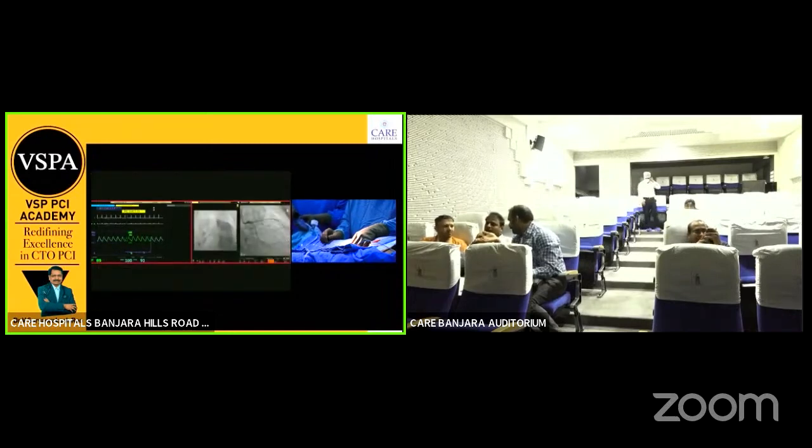Done. 6, 8, 10, 11 nominal, sir. Cranial.